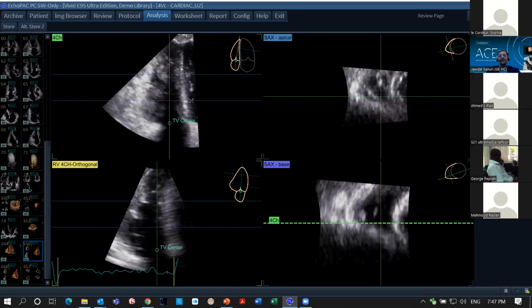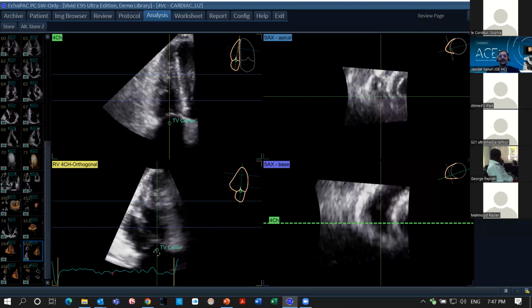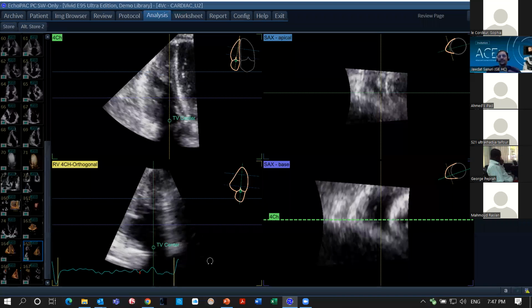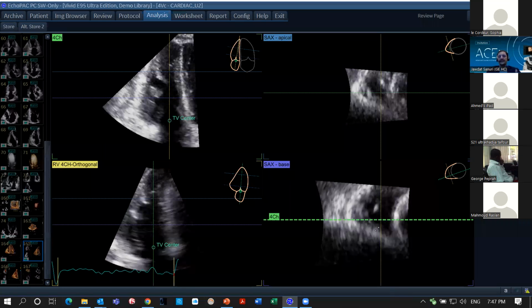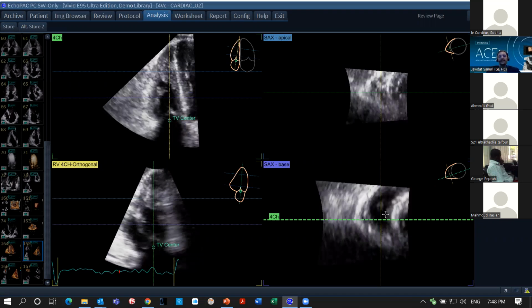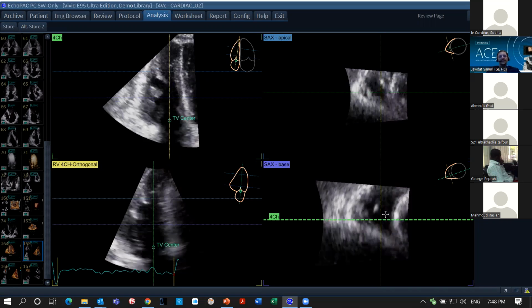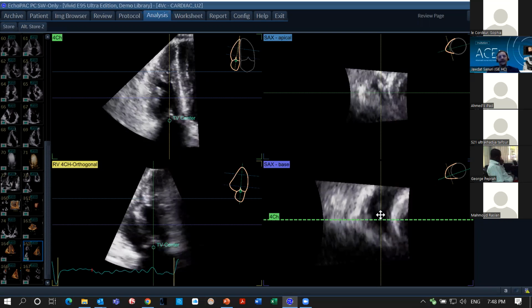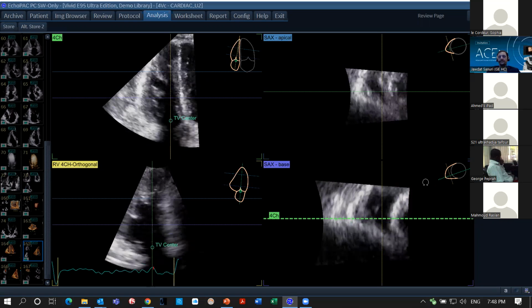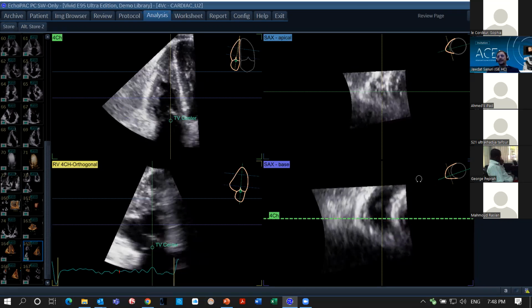have it on a proper PC rather than a laptop, because laptops always have limited graphic cards versus PC, where we could easily compromise the quality of the navigation and cropping, and even the menus sometimes may not appear well. So it's always better to have a real powerful graphic card, even if we are doing it on a quote unquote laptop. At least it has to be a very powerful graphic card type of laptop.